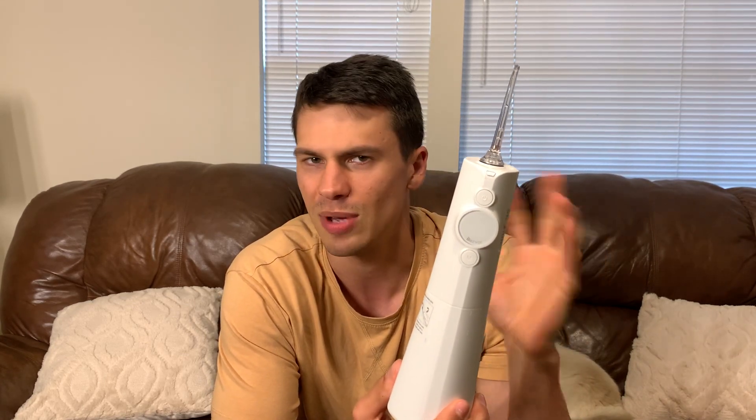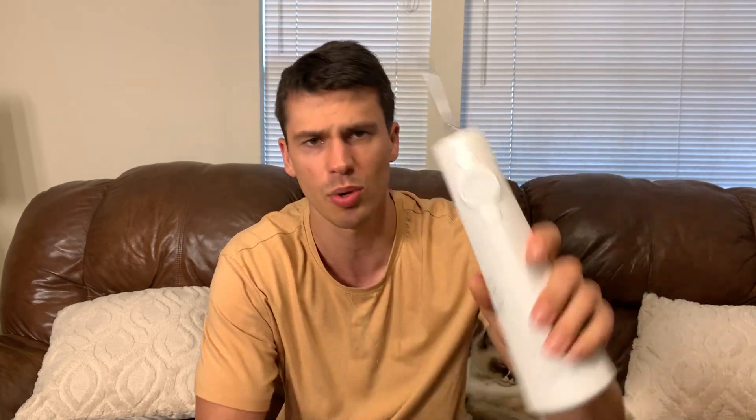That's a quick overview on this. If you're somebody that really likes that really clean feeling in your mouth, this definitely gives you that. And like I said, don't let the irrigation name fool you — this thing shoots out with some force, which is awesome. That's much more than I was expecting, which is fantastic. But that's just a quick overview of my experience with this. Thanks so much for watching and enjoy the rest of your day.